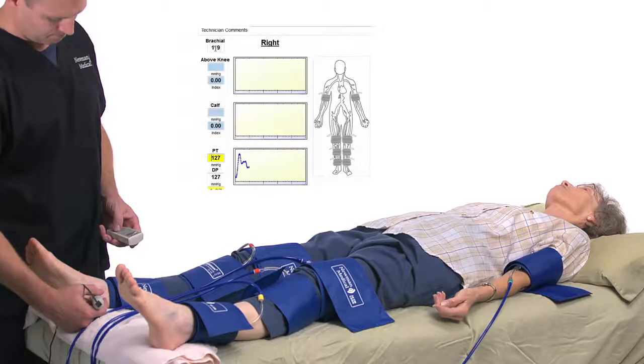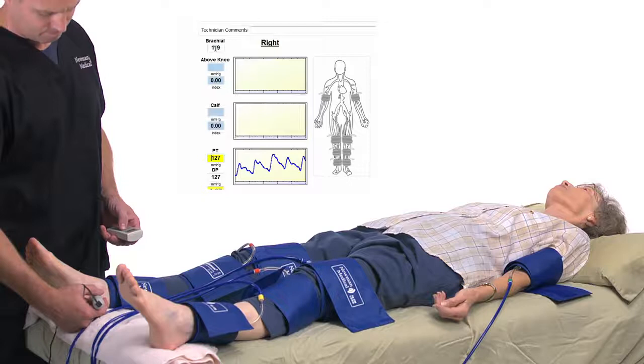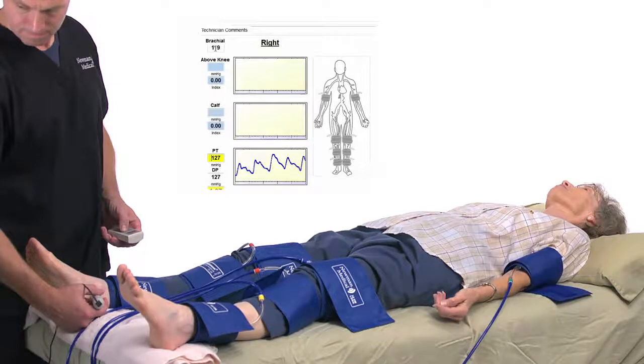To obtain a PVR waveform at the ankle cuff, press the button with the waveform image on it on the remote. The cuff will inflate to the proper pressure and hold that while the waveform is obtained. 5 seconds of waveform data is captured after the cuff pressure stabilizes at 65 mm. The patient should remain still during the measurement. You can repeat the measurement by pressing the waveform button again. When satisfied, press Next to move to the right calf.